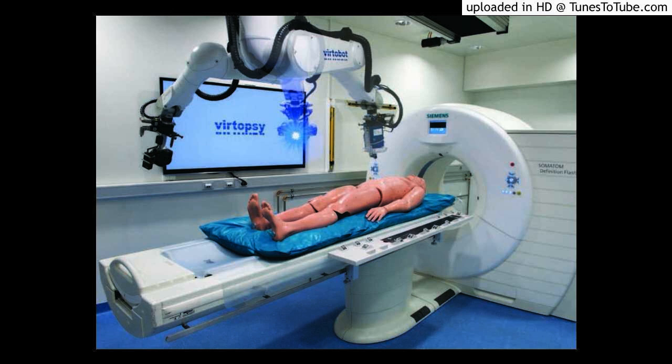It also demonstrates calcifications such as coronary sclerosis and larger vessels easily, and can be used in conjunction with postmortem angiography. Magnetic resonance imaging. Contrast-based MRI is a non-ionizing imaging modality which can illustrate soft tissue injuries and pathologies clearly and is also useful when examining living victims of assault, such as manual strangulation. Postmortem biopsy.